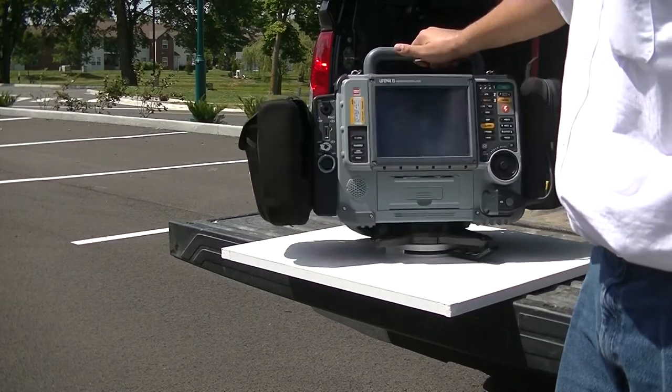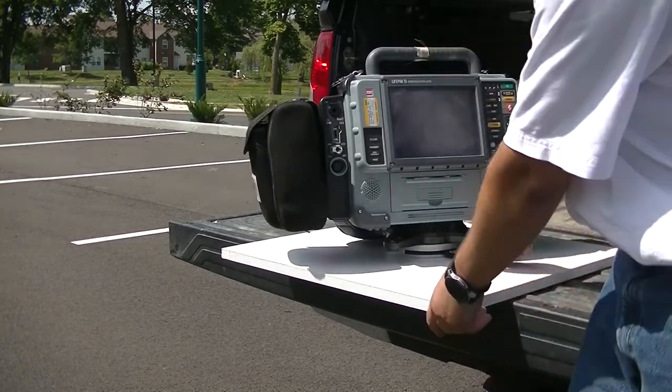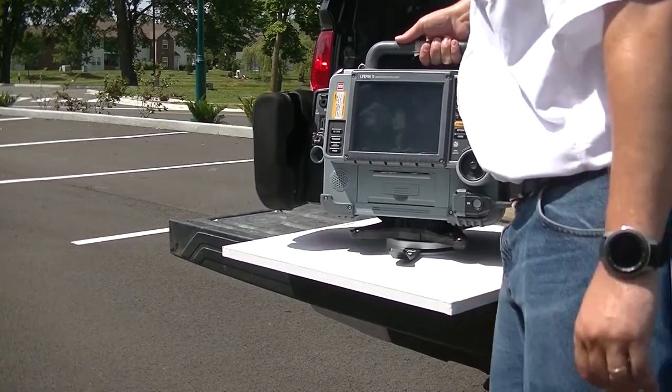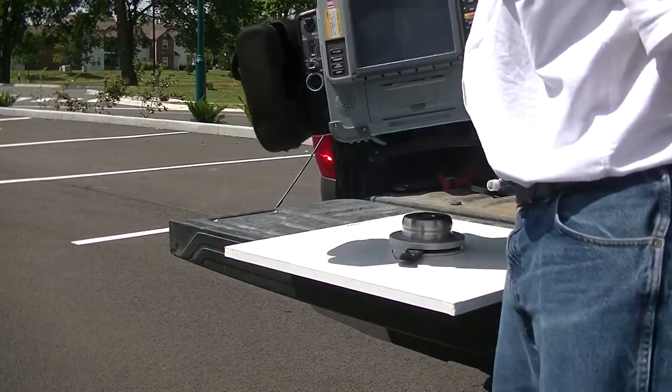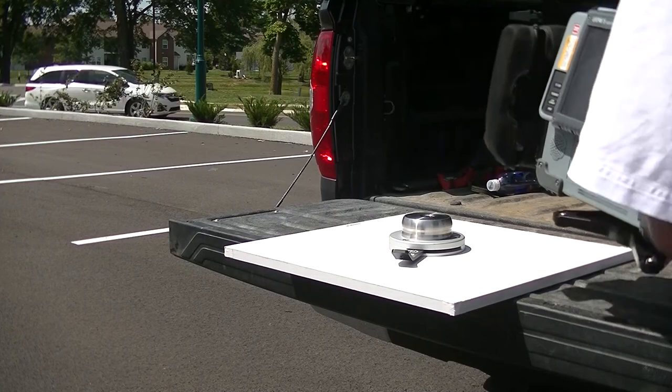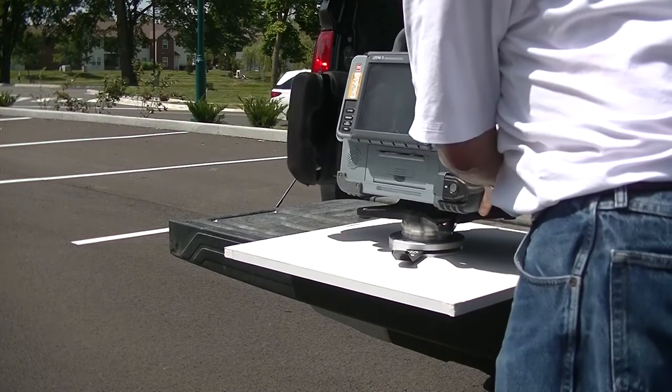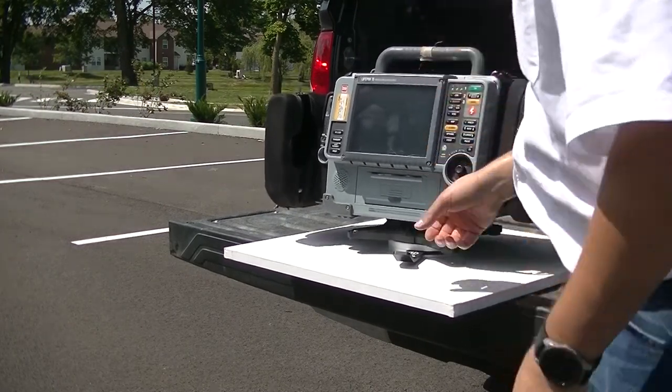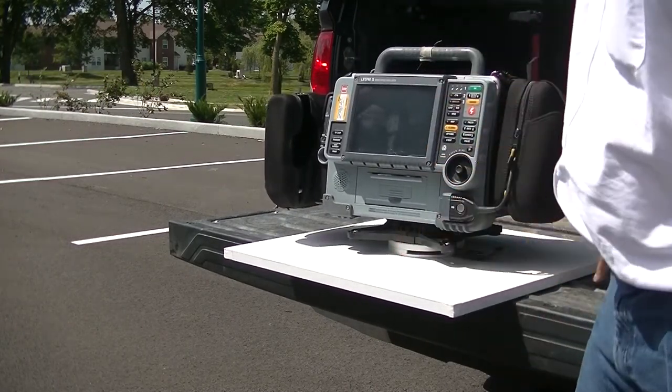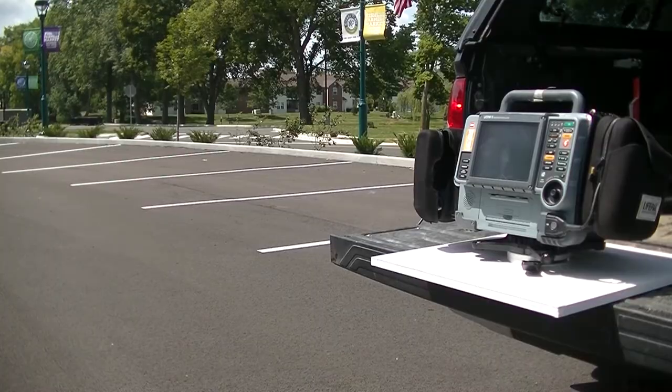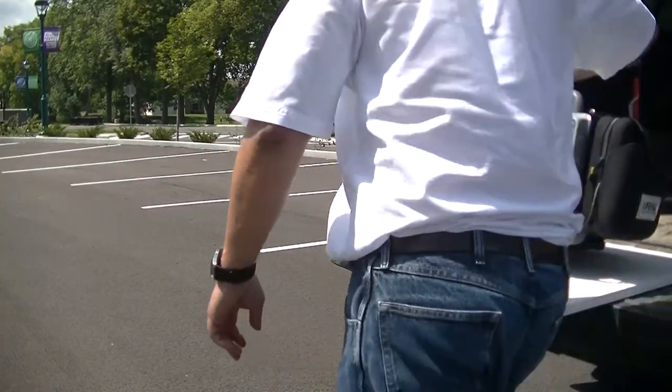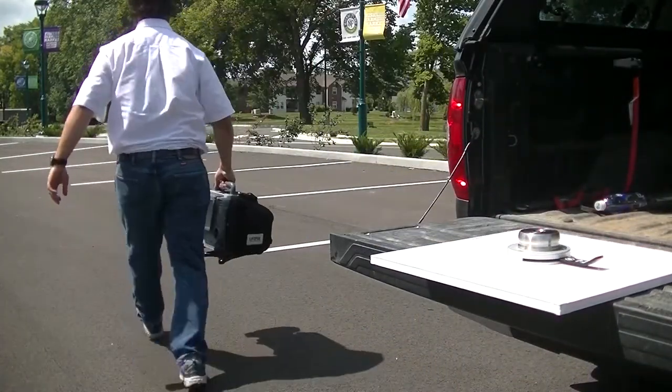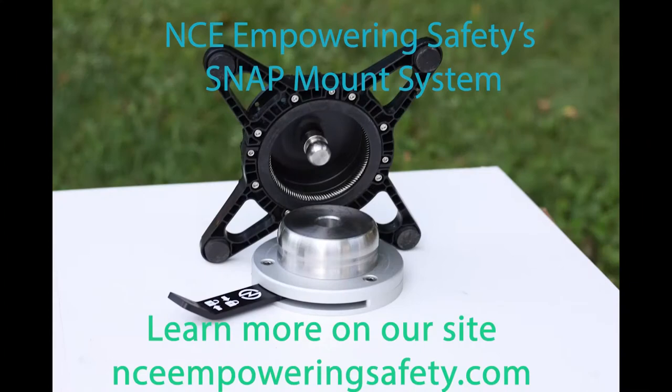The Snap Mounted Adapter is mounted, attached securely to the bottom of the LifePack 15 monitor defibrillator. Stable, lightweight, low profile addition for quick and easy use by anybody who needs to use.